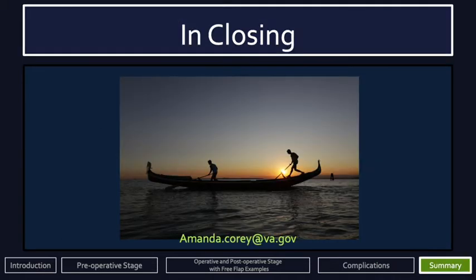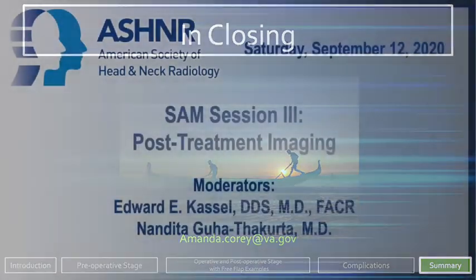In closing, I hope you have a better understanding of the common free flaps used in head and neck reconstructions. These cases are complex. The baseline postoperative exam is often the most challenging, but with a structured approach to these patients, the imaging interpretation can be more straightforward. Thank you for your attention.